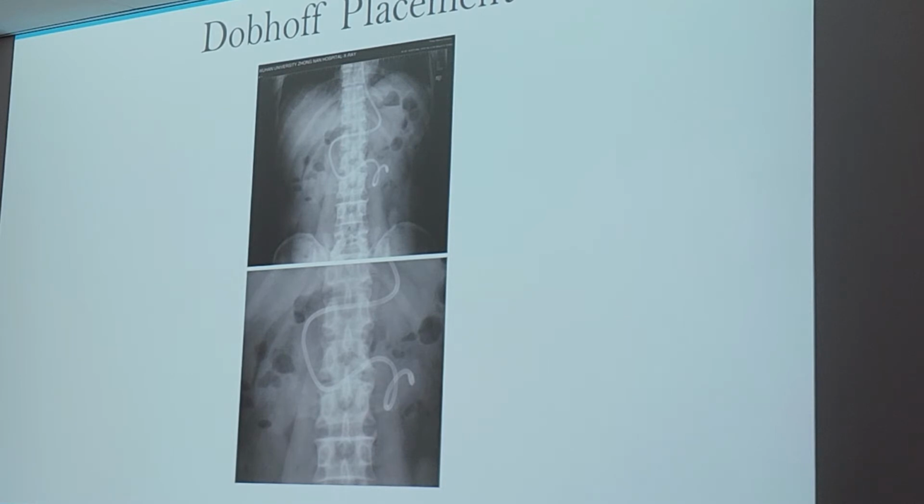But the kink, you mean a twist sort of thing? Yeah, it's twisted and bent, so we don't want it to be bent, because that might be a potential blockage if you're trying to feed them.